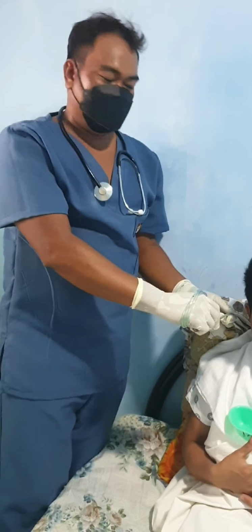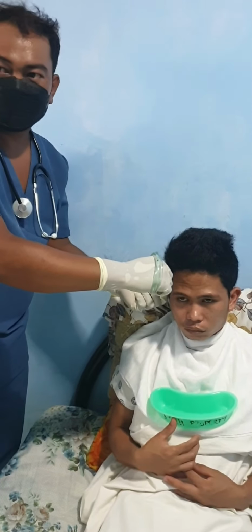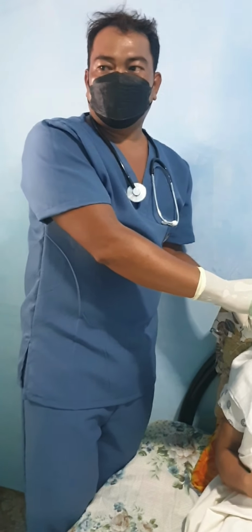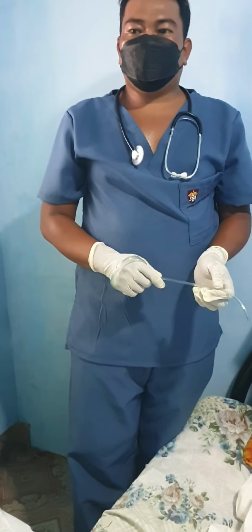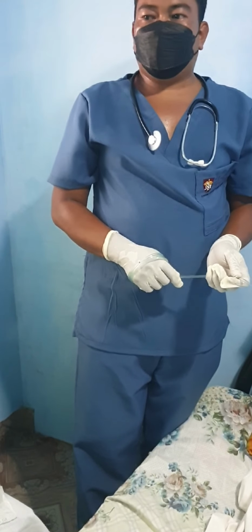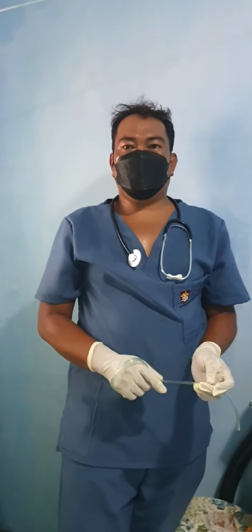Twist the tube slightly, apply downward pressure, and continue trying to advance the tube. If significant resistance is felt, remove the tube and allow the patient to rest before trying again in the other nostril. It is common for the patient to feel discomfort, and this may be expressed with coughing and gagging. More aggressive coughing and gagging may indicate that the tube has entered the airway, in which case you should withdraw the NGT.